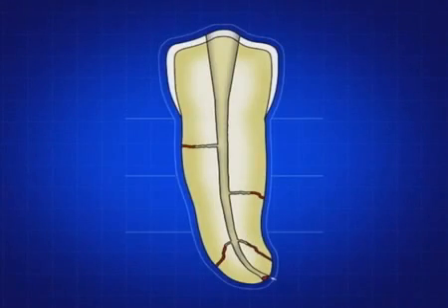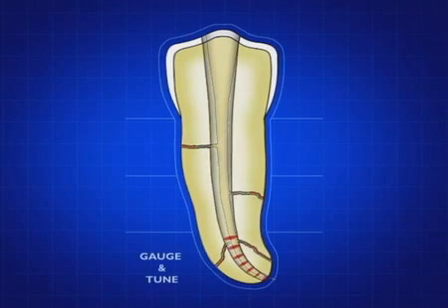As mentioned previously, a Type 1 transportation represents a minor movement of the physiologic foramen to a new iatrogenic location. In these instances, the clinician must weigh risk versus benefit when trying to create an apically tapered canal that is narrowest at the terminus. If sufficient residual dentin can be maintained and shape created above the foramen, then these iatrogenic cases can be three-dimensionally cleaned, shaped, and packed.